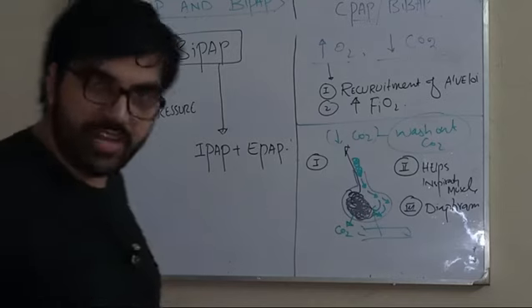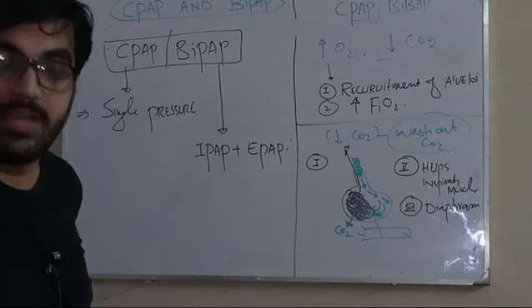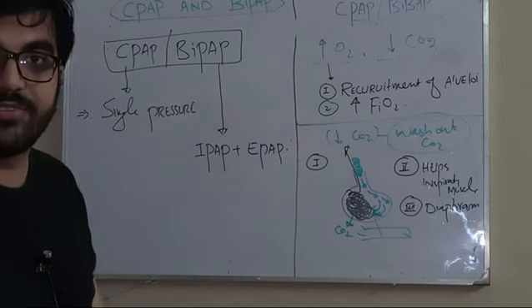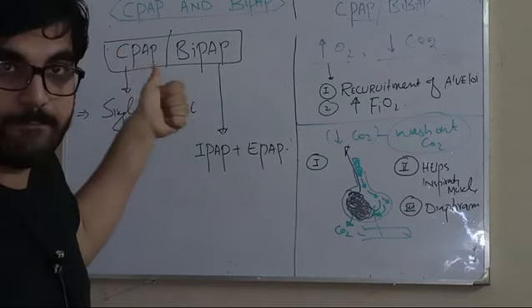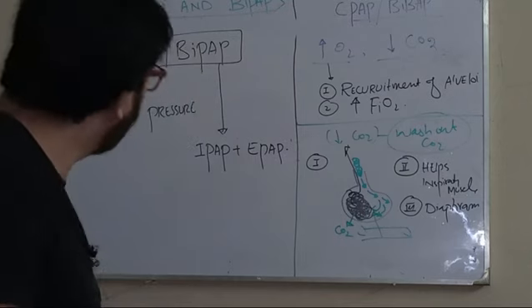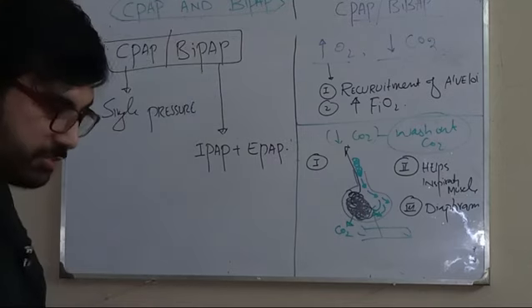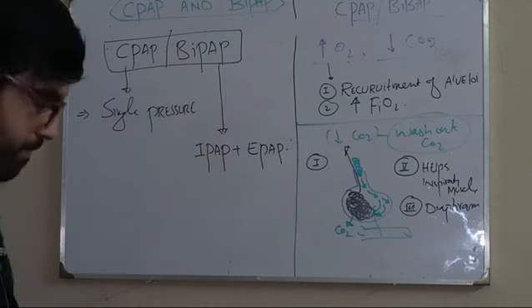So this is a more advanced type, but still the CPAP are used. Why? Because of economical reason. CPAP is cheap and easily available. BiPAP is expensive. So that is the main difference between the two, and the best is the BiPAP as compared to the CPAP.